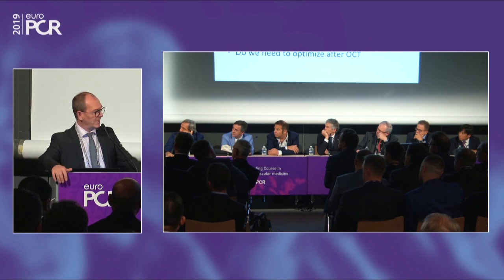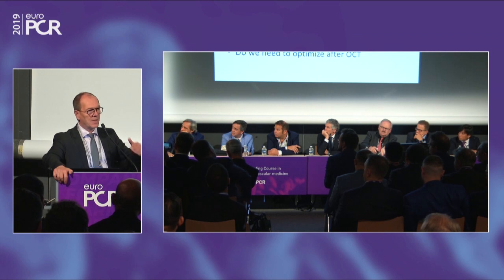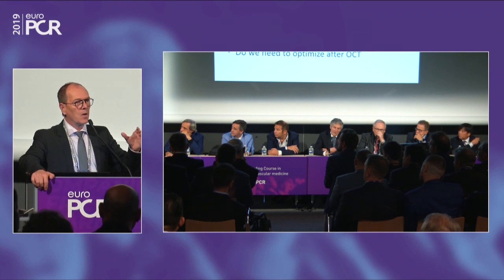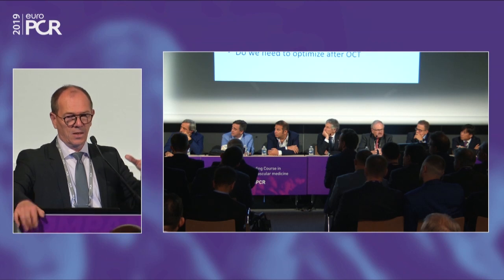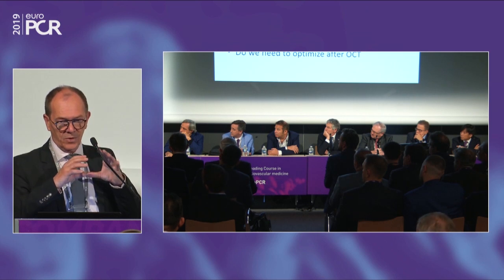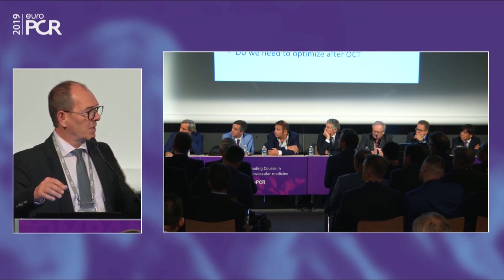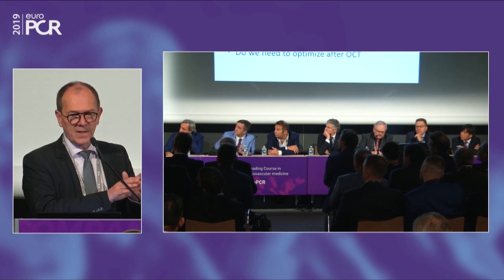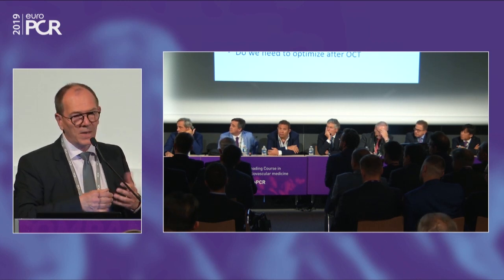And your question is very interesting. We had this part of the discussion with Thierry many times. Most probably, that's the way we developed the POT technique when we discussed with Gérard Finet. When you perform a POT, you increase the size, like a pair of glasses, on the proximal part of the stent and in front of the stent. So some guys developed the snuggle technique, a short balloon to perform the kissing, to be sure to be outside of the stent. So when you are outside of the stent, you make another stretch.